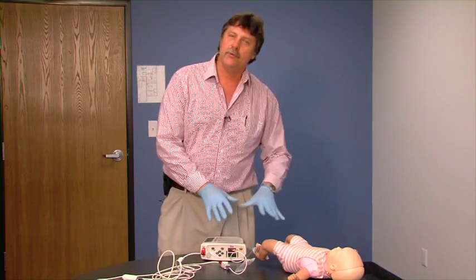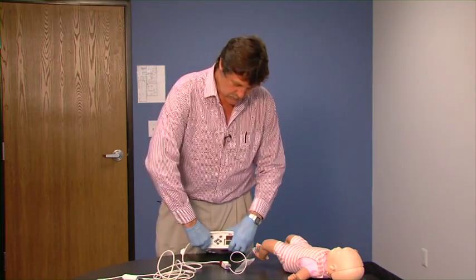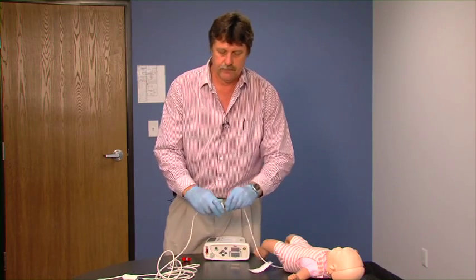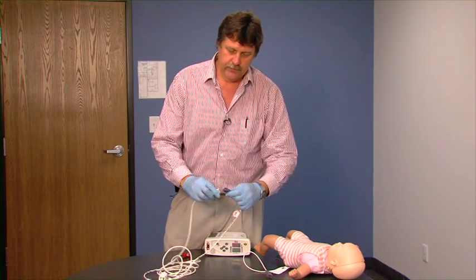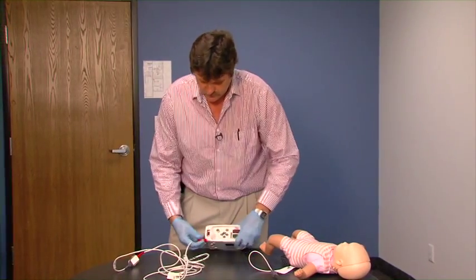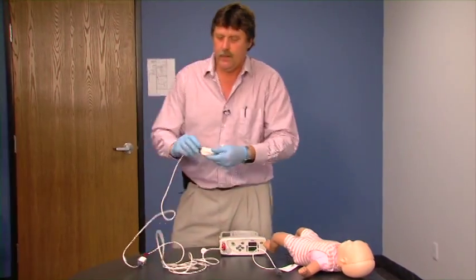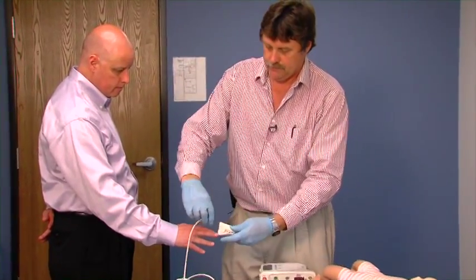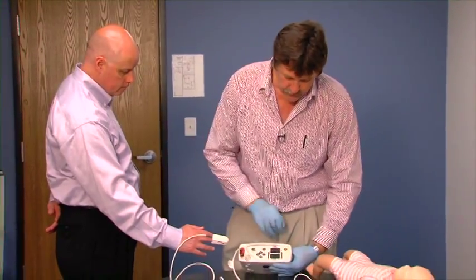This is how we would set it up on an infant. However, if we have an adult, then we use a different probe — we'll use the finger probe. We take off the current probe and insert the finger probe, then lock it into place. There is a depiction of the finger on top of the unit so that you know which side is up. We'll put that on our patient and see what our values are.